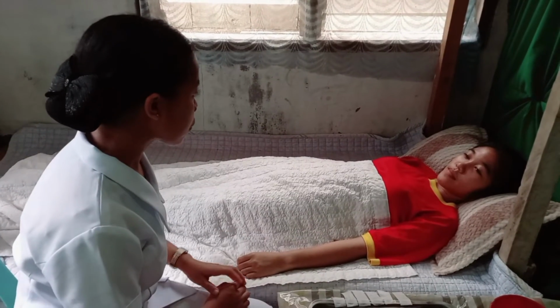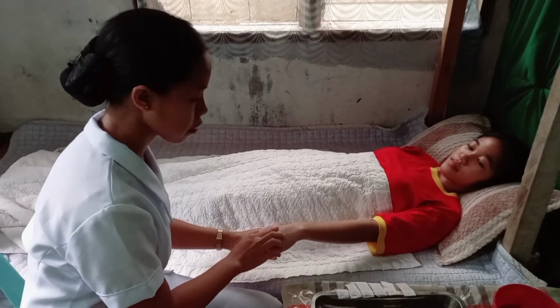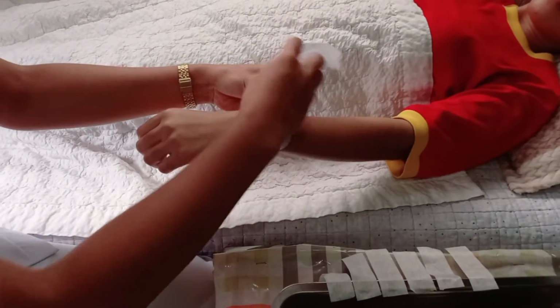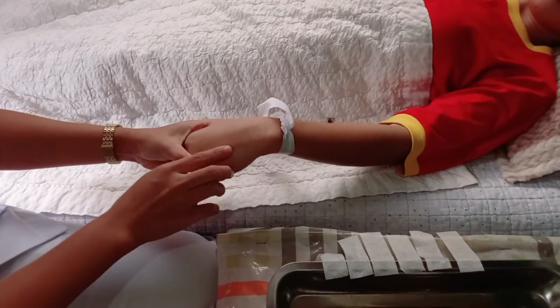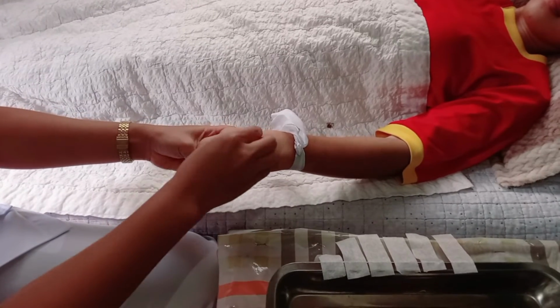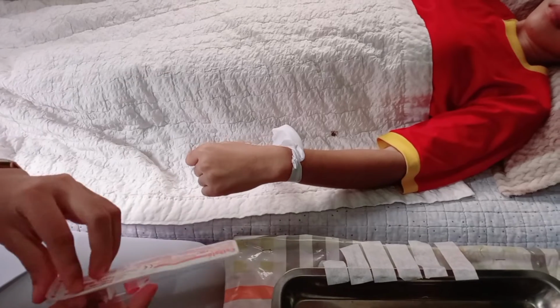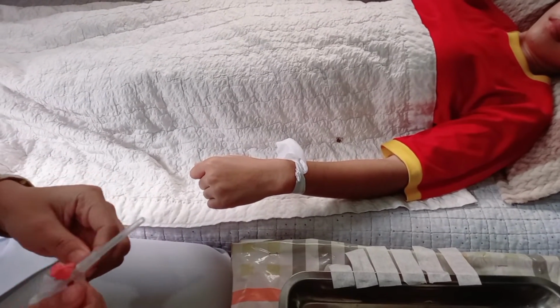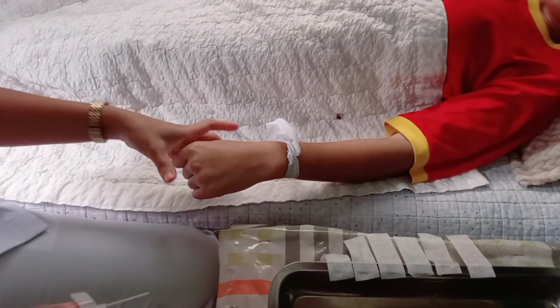Ma'am, asay mo ba yun nga kamot, ma'am? Dari. Sige, diri ko magtaod, ma'am, ha? Taod na ko, ma'am, ha?